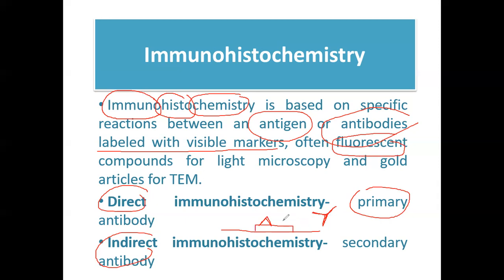And this reagent antibody is known as your anti-rabies antibody. So, kapag nilagay natin yung ating reagent antibody and incubated it with our specimen, magbabind ngayon si reagent antibody with our antigen. Fluorochrome-labeled siya. This is a fluorescence assay, so we'll read the result under your fluorescence microscope. Kung nagbind siya, makakakita ka, for example, kung FITC yung ginamit mo, apple green fluorescence. So, isa lang yung antibody, primary antibody.